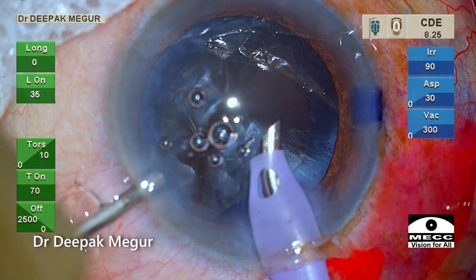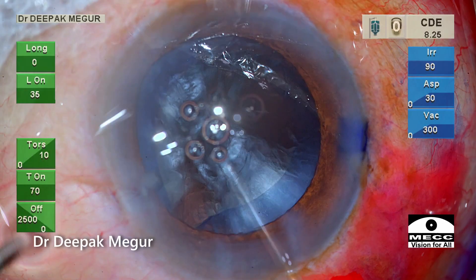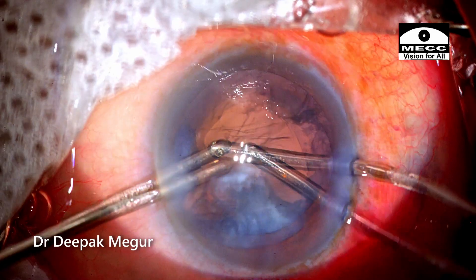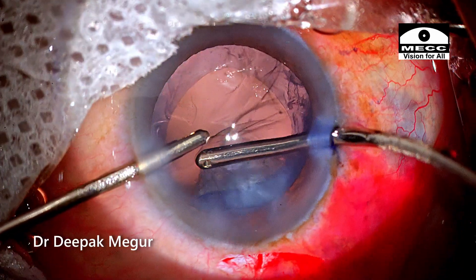Before coming out, OVD is injected into the anterior chamber and then the phaco tip is withdrawn. This important principle of never allowing the chamber to shallow helps minimize the chances of the radial tear extending onto the posterior capsule.